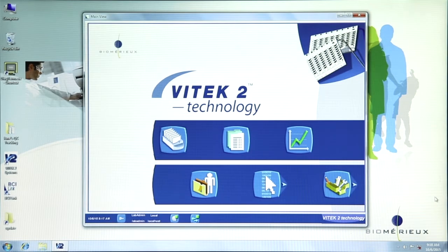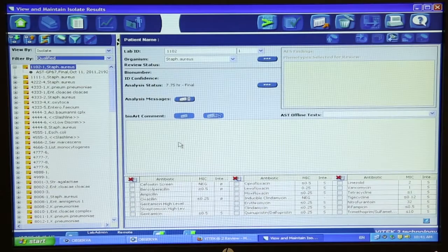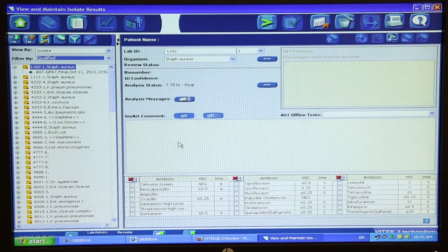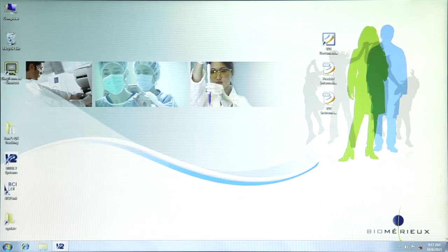The Vitek 2 system software is used to communicate with the Vitek 2 instrument. Card data is transferred from the instrument to the software where it is analyzed into identification and susceptibility results. User security is managed by Windows for both types of software. Therefore, most of the tasks covered in this video are performed in the Windows software. Since this video covers multiple security tasks, each one is represented by a button. Click the appropriate button to view information specific to that topic.